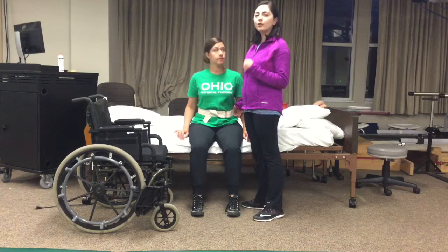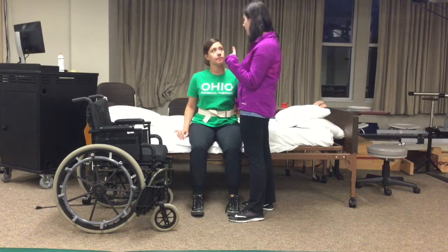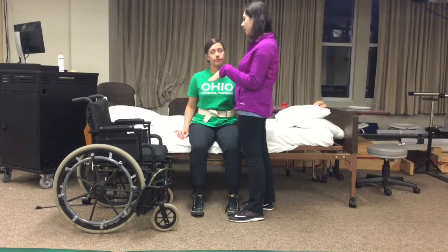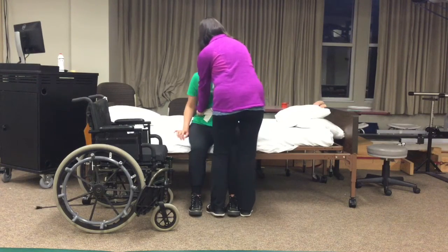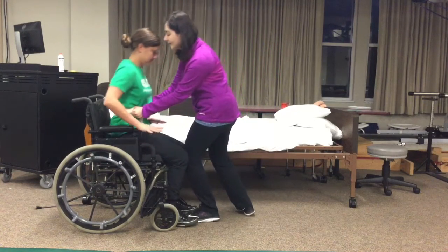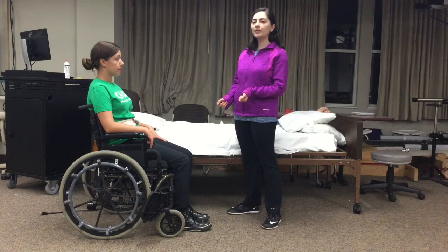Make sure to provide instructions to the patient so that they know what you are going to do. So Jen, we're going to transfer from the bed into the wheelchair. On the count of 3, you are going to lift yourself up. I'm going to be stabilizing you so you won't fall. And then we'll pivot and we'll sit in the wheelchair. Does that make sense? Okay. Okay, let's start. Ready? 1, 2, 3, and pivot, and sit.